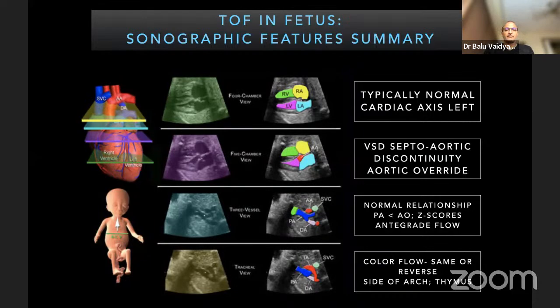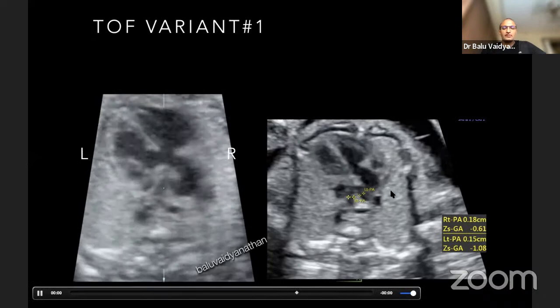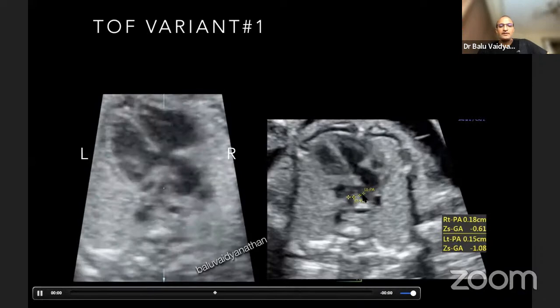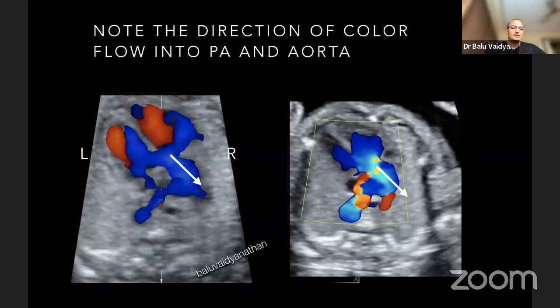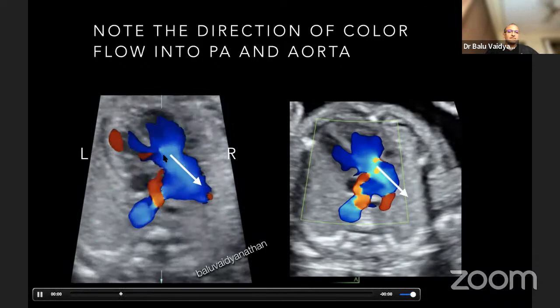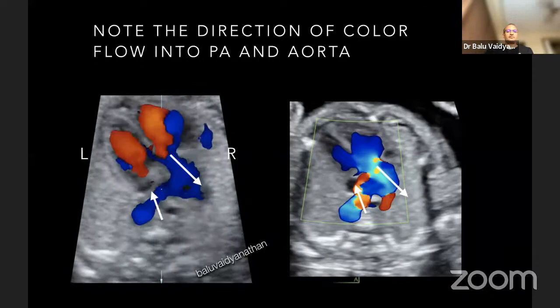Let us look at a couple of variants. This is another case where you see an overriding aorta, a large aorta. When you look carefully, the branch pulmonary arteries are seen — the RPA and LPA are very small structures. When you look at color, there is forward flow into the aorta with a lot of aliasing, and even a bit of aortic regurgitation. There is retrograde flow into the pulmonary artery, meaning pulmonary atresia. No antegrade flow into the PA — only retrograde flow through the ductus arteriosus — and the branch PAs are very small.